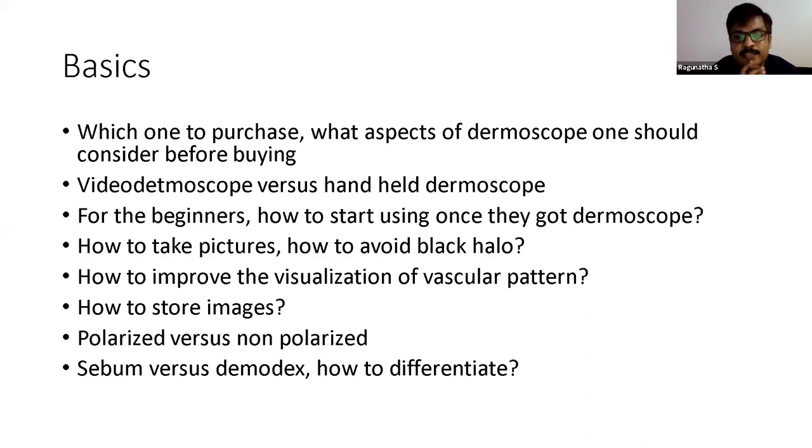Another differentiation we look for is between sebum and demodex. Both appear almost the same, and I would like your opinion on how to differentiate sebum and demodex. Balchandra? As per my discussion with Dr. Enjo regarding this, sebum excretions are seen in a few conditions, for example dyssebacia, seborrheic dermatitis affecting the face, and demodex folliculitis.